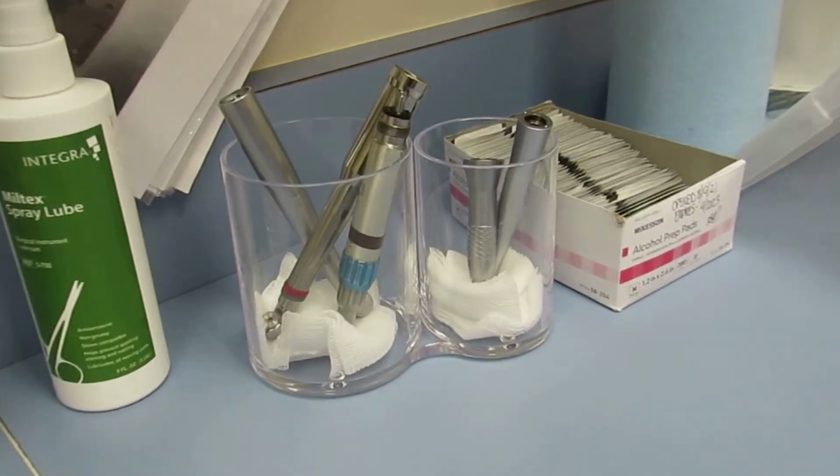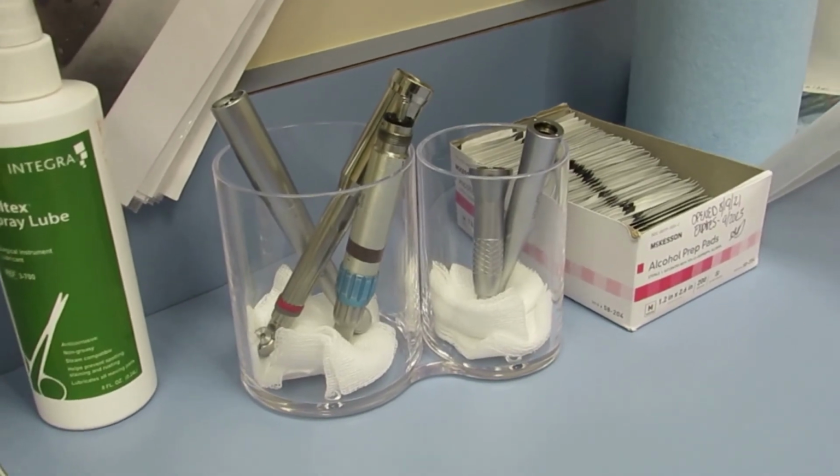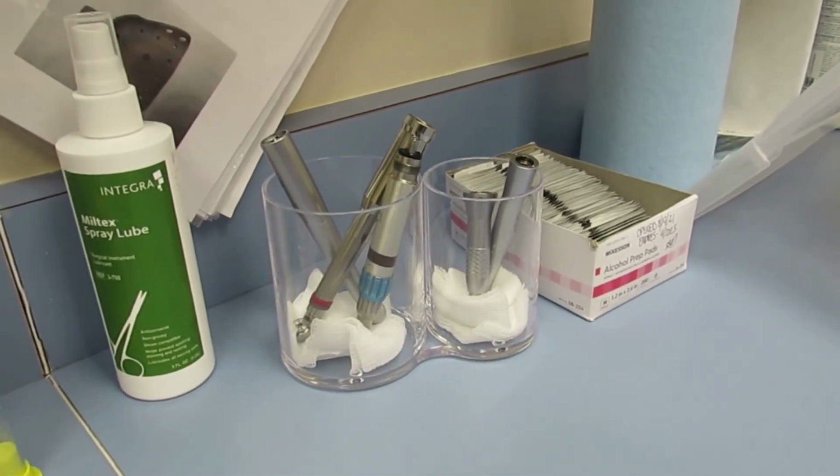Now that the handpieces have been through a vigorous process, they are ready to be sterilized.